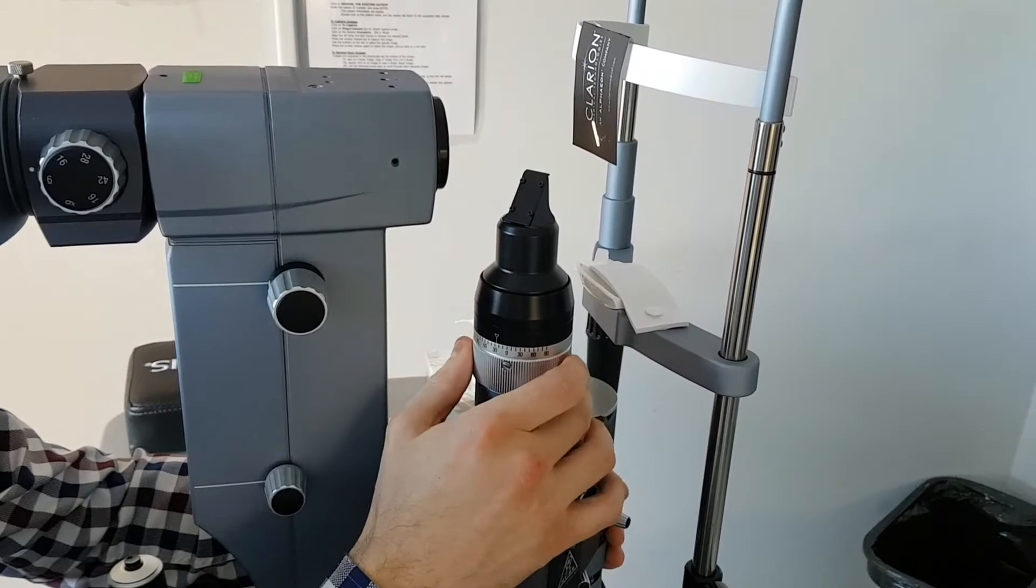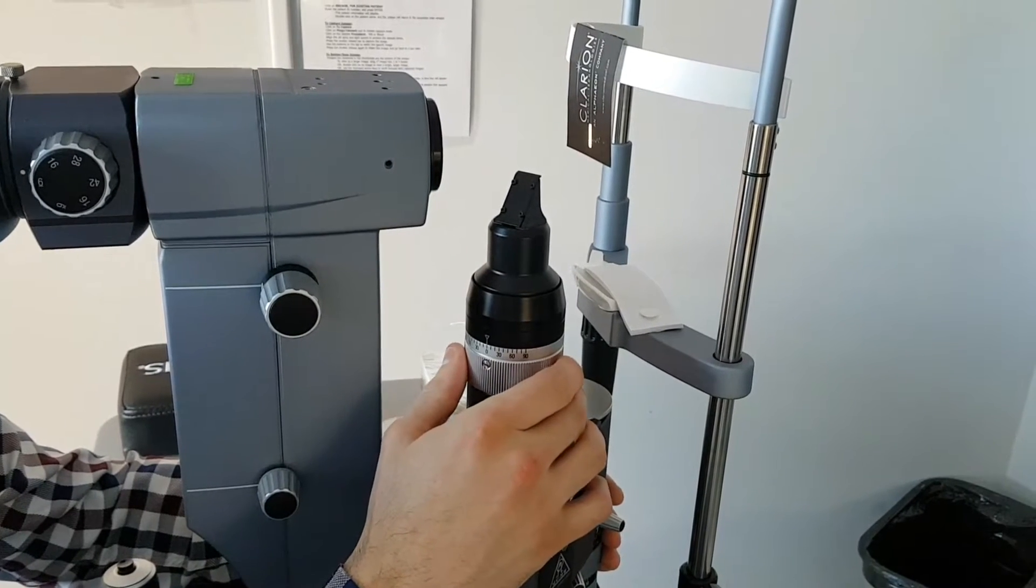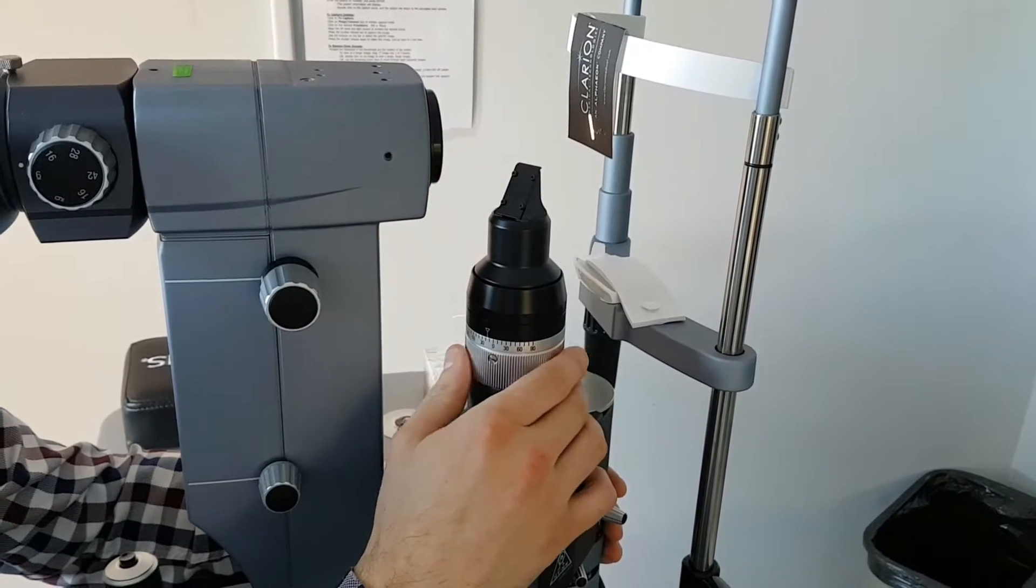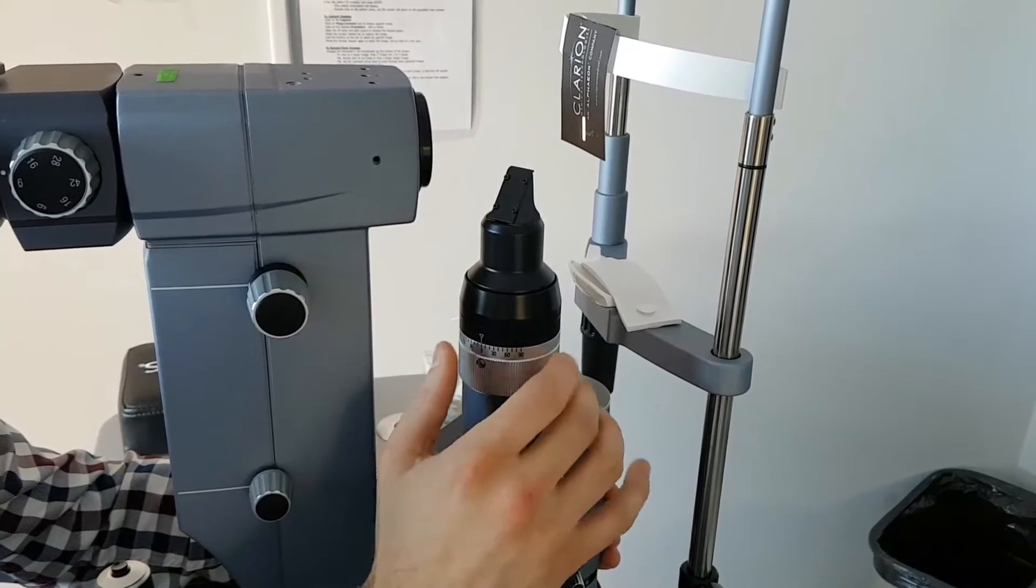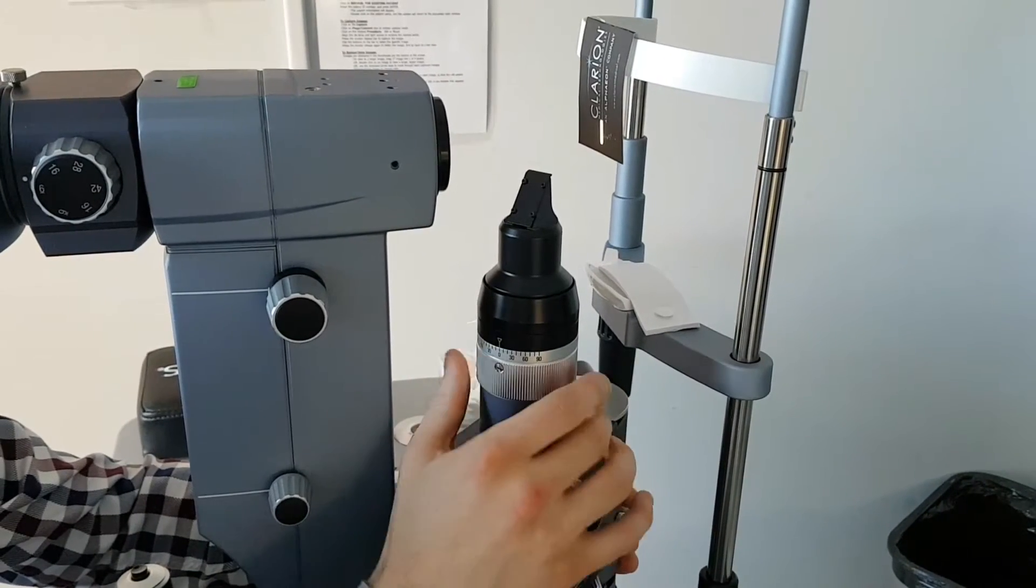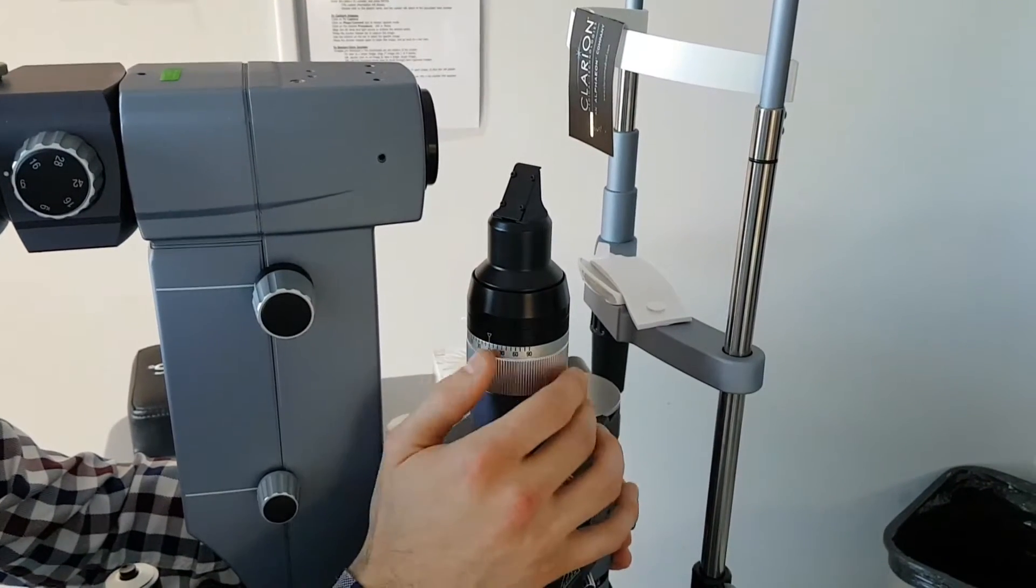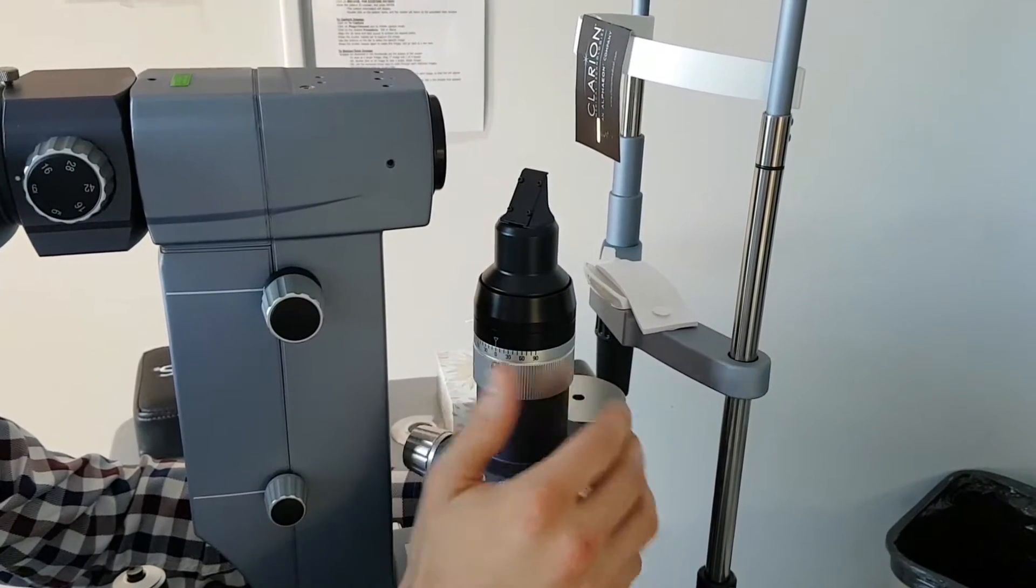If you happen to come and the slit is at an angle, someone may have played with this big wheel here. Set it to zero and it should be straight.